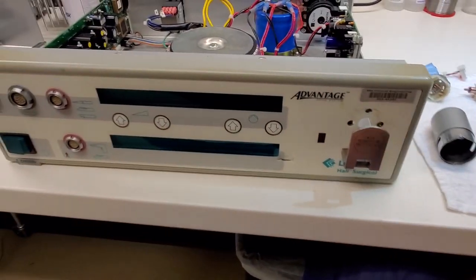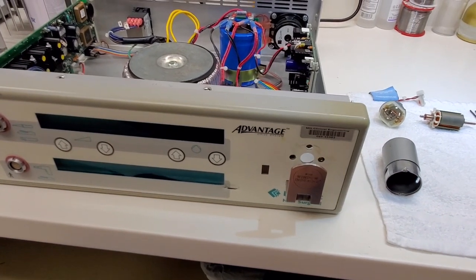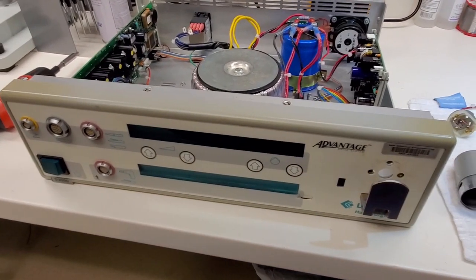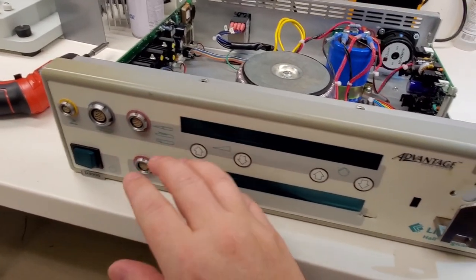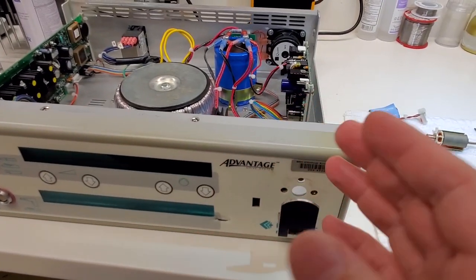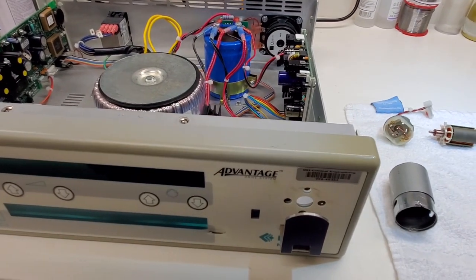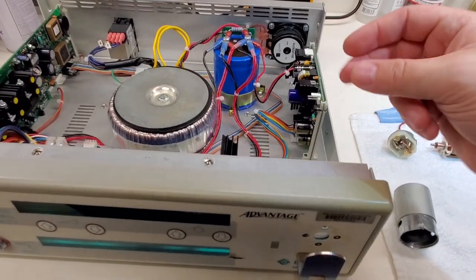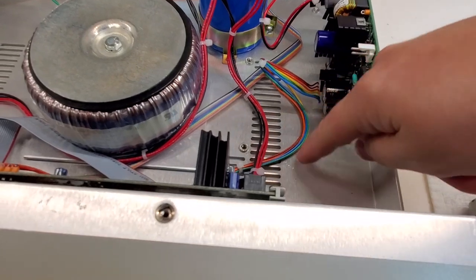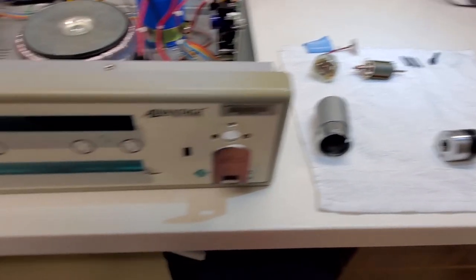So this guy, it turned on, everything behaved normally, and the motor supposedly wasn't spinning. And I thought, all right, let's just take a look at this guy, because getting a handpiece, getting a foot control and all that, that's a lot of bother. If they're saying that the irrigator motor doesn't spin, a unit this old, there's no visual indicators on the outside of the motor that there's dust or brush debris on the inside or on the inside of the chassis. Normally you have a bunch of brush debris down here. There's nothing. So you would think that that motor looks like it's brand new.